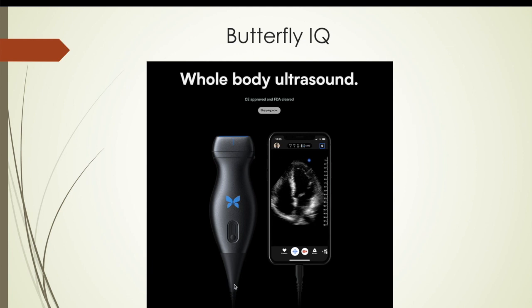You can see it hooks into your iPhone or iPad via either lightning connector or USB-C, which I'll go over and talk about a little bit later.